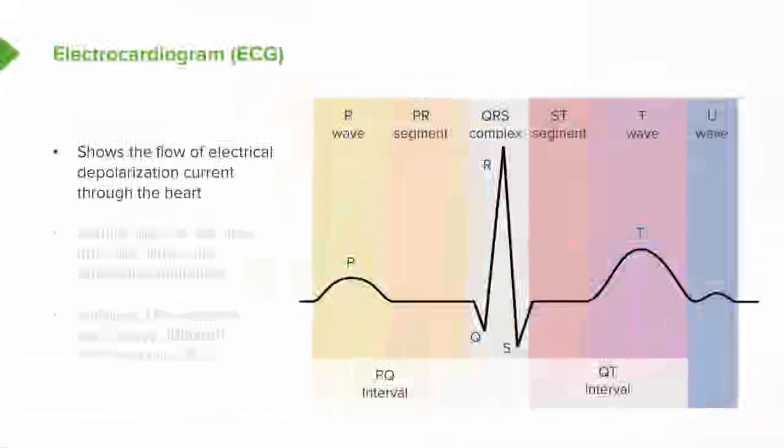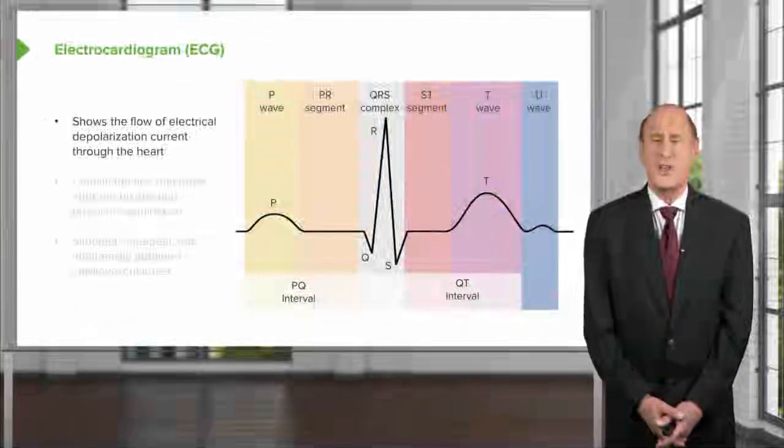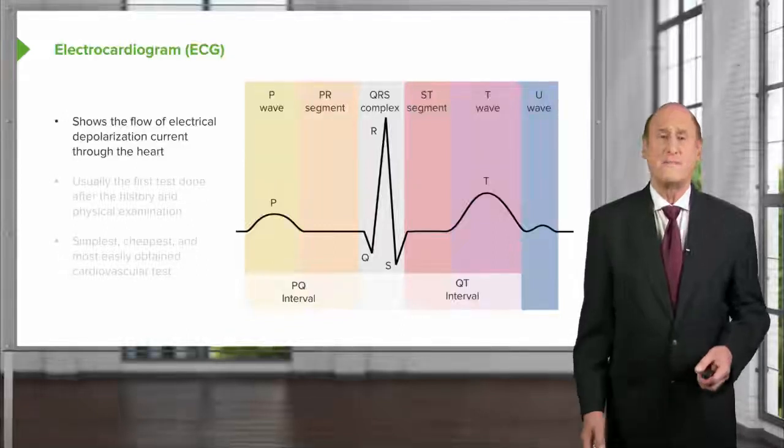You then see in gray the QRS complex. That's the depolarization of the ventricle, of both ventricles, by the way, right and left, although the left has a lot more muscle, so the QRS is dominated by left ventricular muscle depolarization. There's then an ST segment, a little pause while the ventricle finishes the depolarization and gets ready to repolarize, that is, to get ready for the next beat, and that's during the T wave. The T wave is the repolarization wave, and then as I mentioned, the U wave is often not present, but may be present as a very small wave following the T wave.